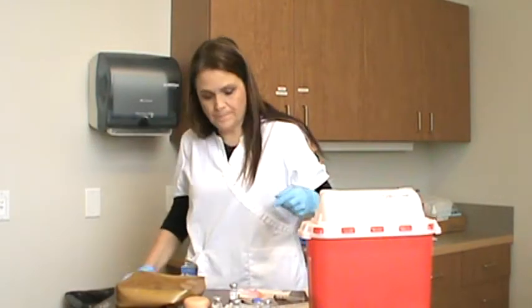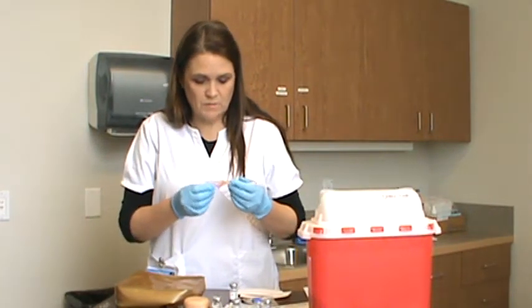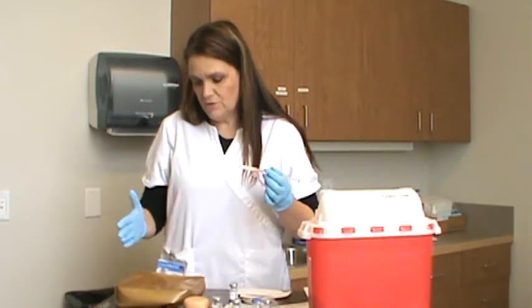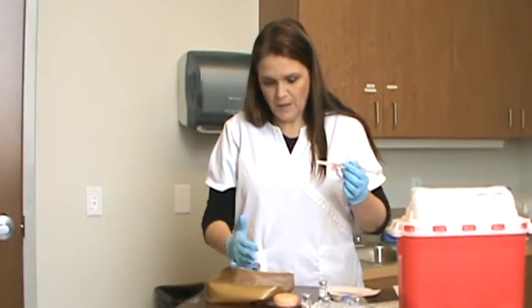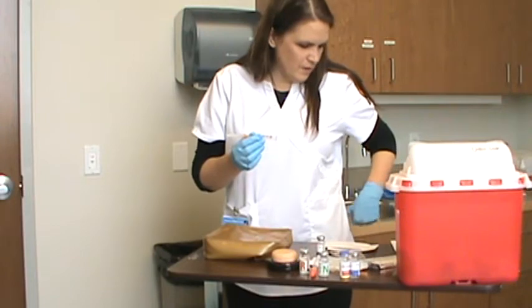Let it dry. And like I said, I checked her respirations, and so she's good to receive this drug. So then you'd use a Z fashion. I would probably give it to her in her dorsal gluteal area.